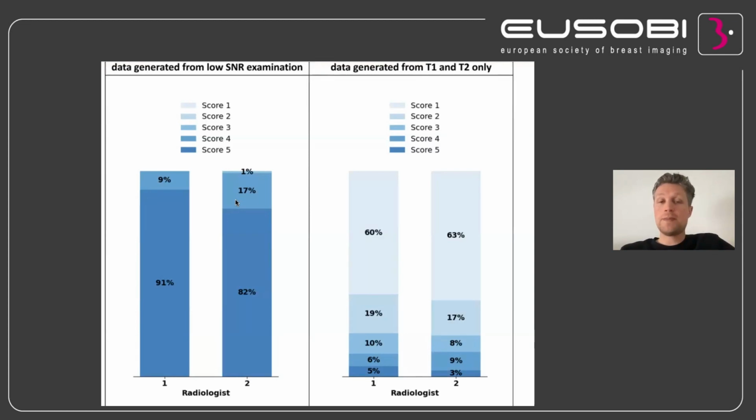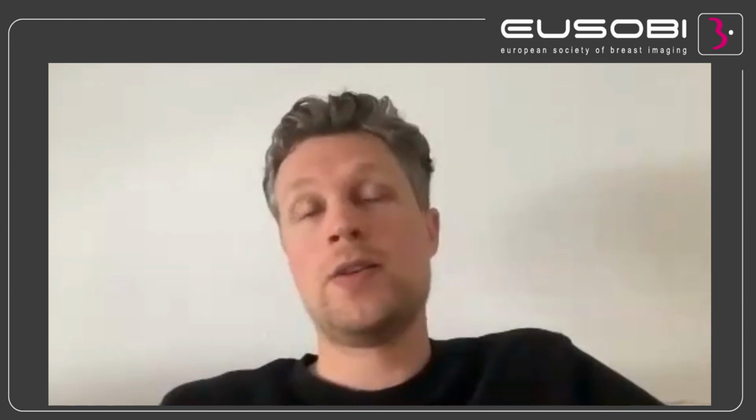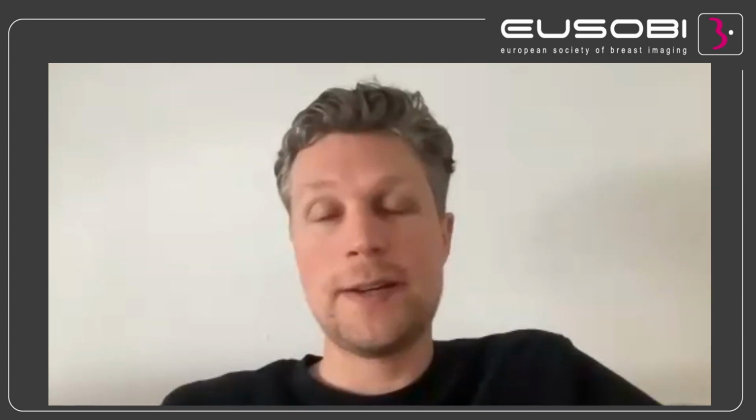And we found that both radiologists agreed that in almost all cases where we used the model in which we input the low contrast image as well, there's a high correlation and a really good depiction of contrast enhancing lesions. However, when we only use the non-contrast images, we find that the scores are much lower. So they are not usable in the diagnostic setting.